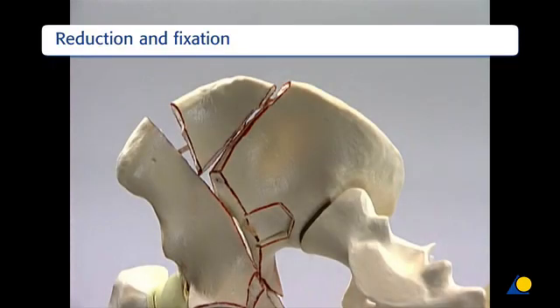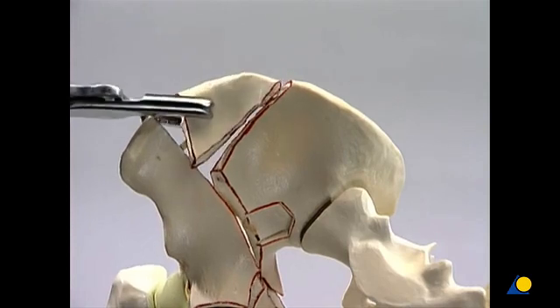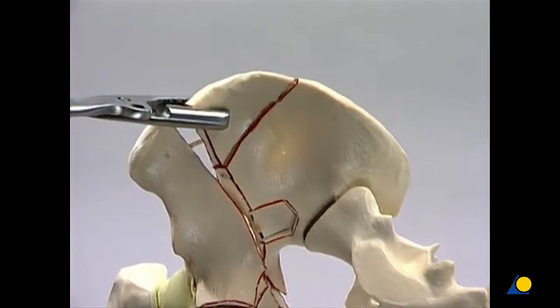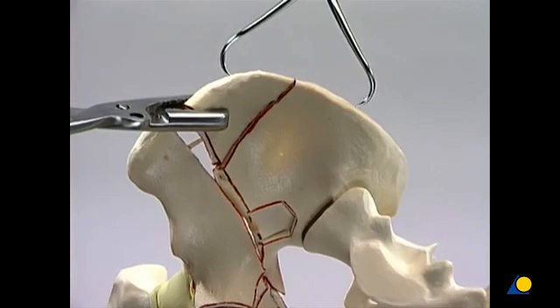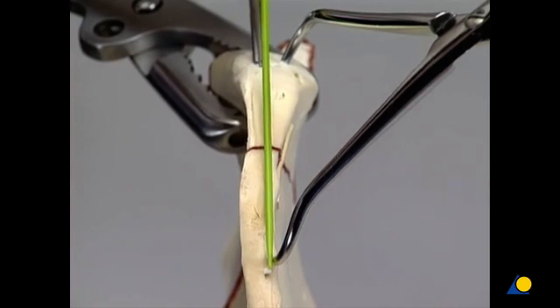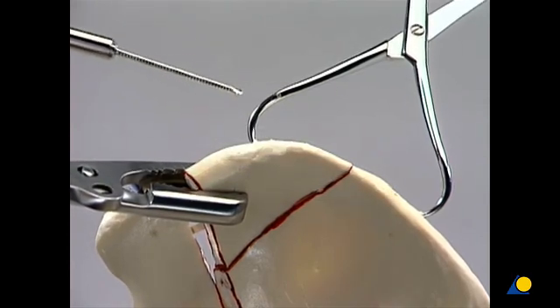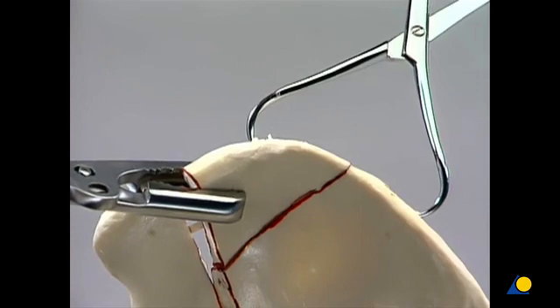The anatomical reduction starts at the proximal aspect of the iliac wing. It is important to restore its normal curvature. A Faraboeuf clamp is used to reposition the free fragment of the iliac wing. The pointed reduction forceps is applied to reduce and temporarily fix the iliac crest. A hole for a lag screw is prepared in the usual manner, close to the peripheral border of the iliac crest. To compress the fracture line, a 3.5 mm cortex screw is inserted. The Faraboeuf clamp is then removed.